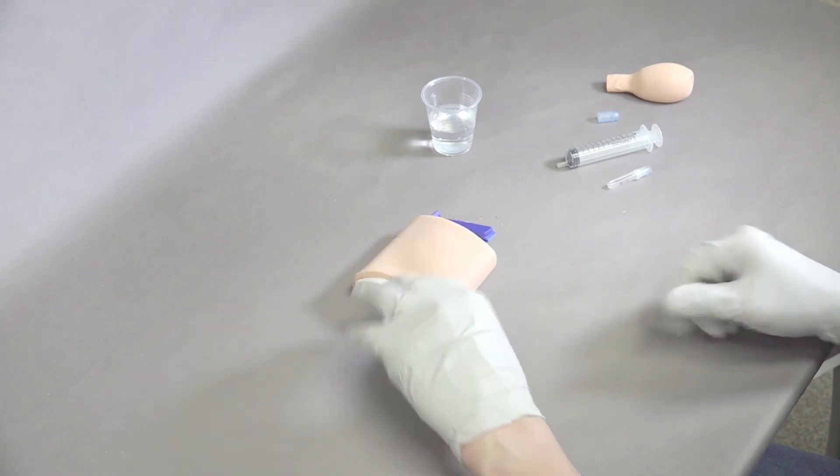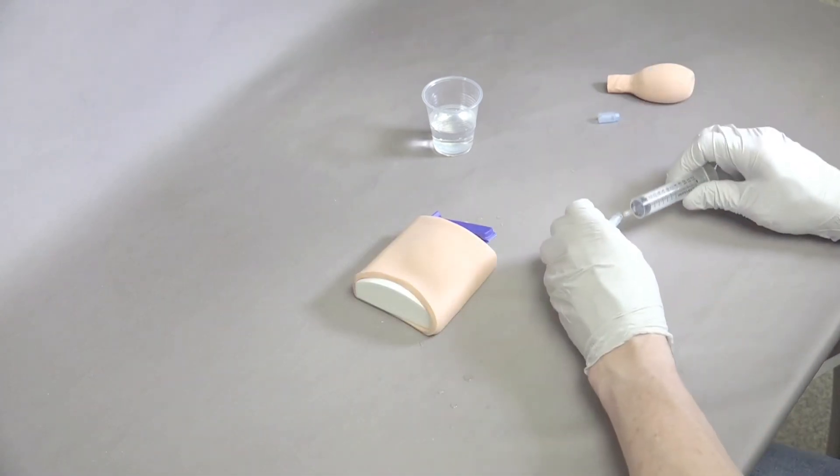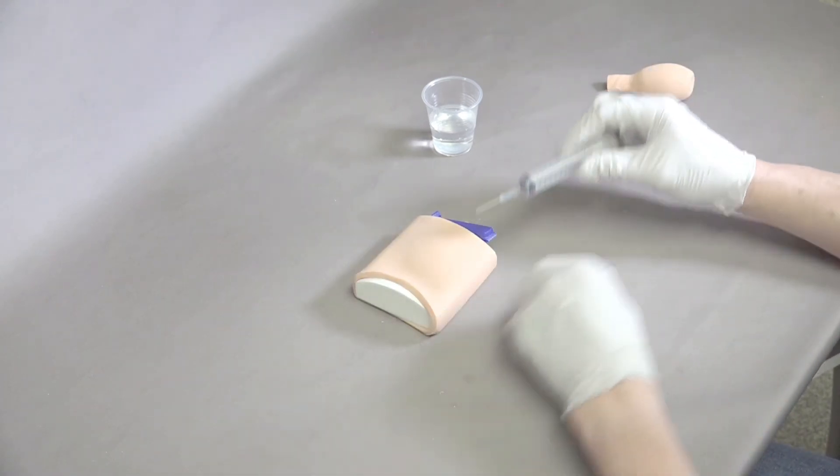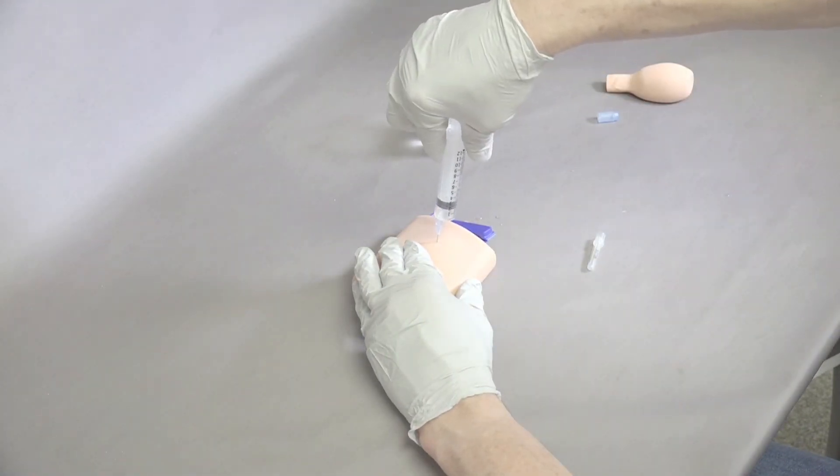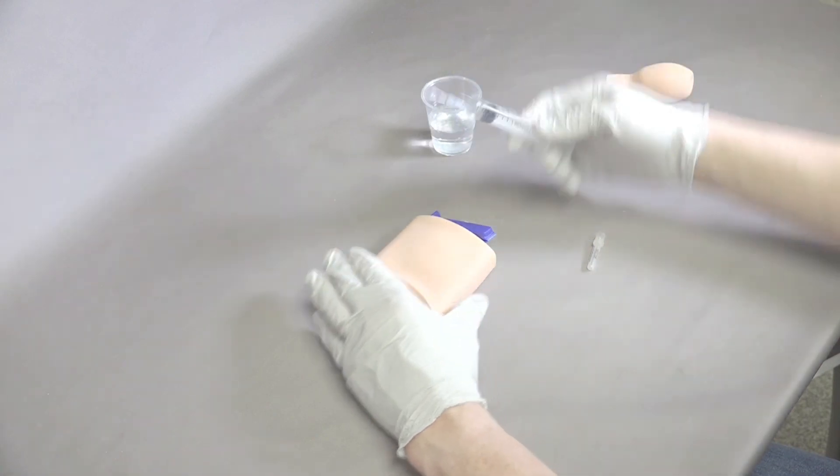Now it's very obvious where the bladder is. Attach the needle to the syringe, palpate, go straight down, and aspirate the simulated urine out of the bladder for a cystocentesis.